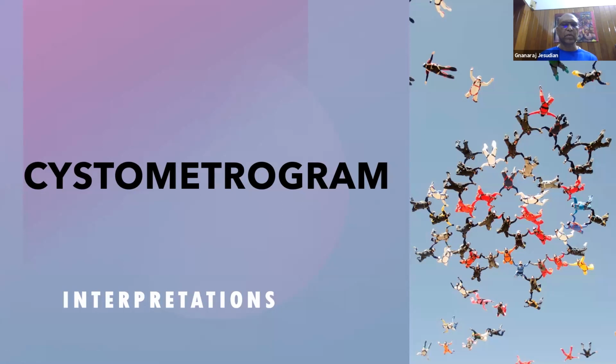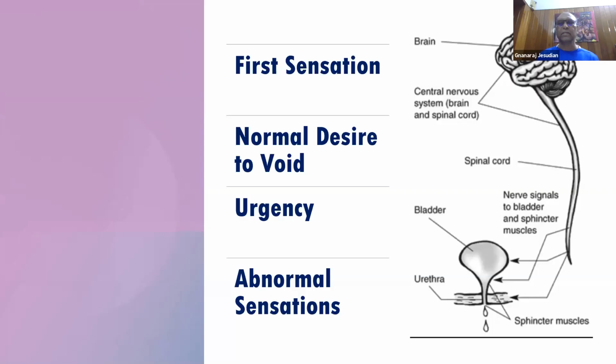Earlier, we learned about what a cystometrogram or bladder pressure study is and how it is carried out in a low-cost setting. Today, we'll discuss how it is interpreted. We said during the last class that the patient has to talk about the sensations that he feels.